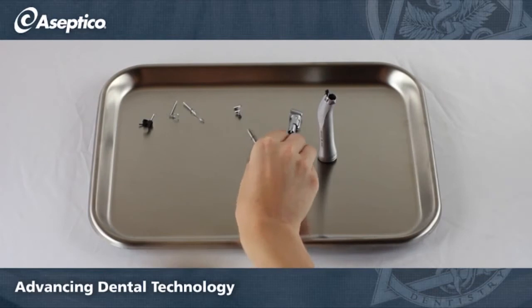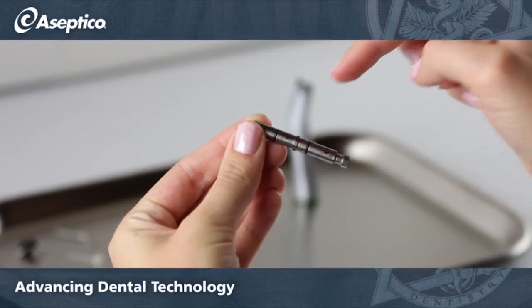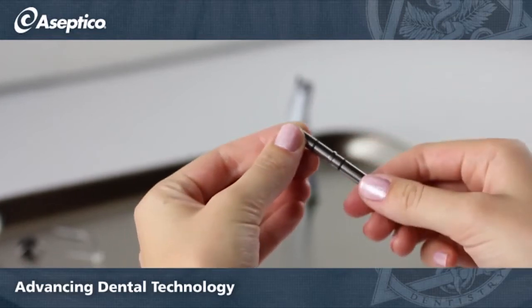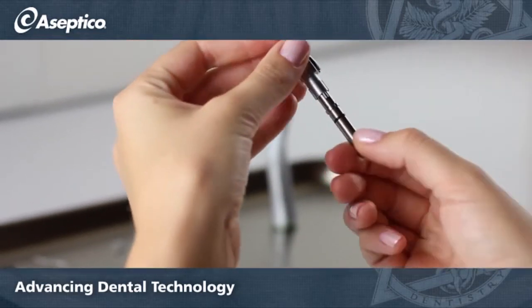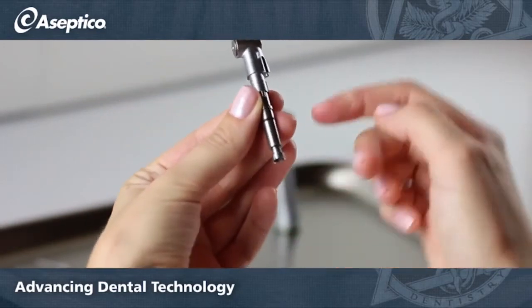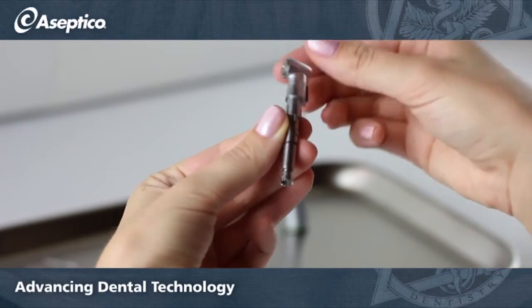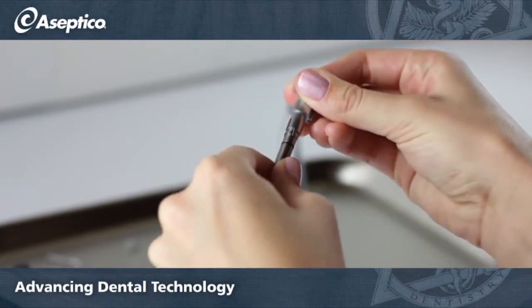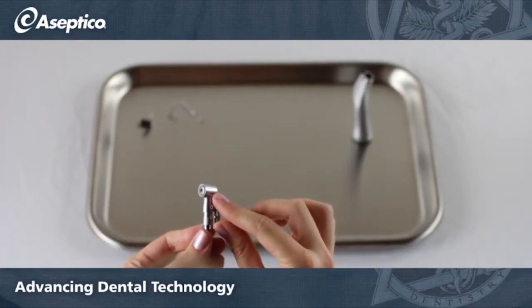Reassembling the handpiece: on the drive shaft assembly you'll notice the numbers 1 and 2 — 1 goes towards the head of the handpiece. Line up the notch on the drive shaft to place the head. The depth stop adapter will slide back into place.